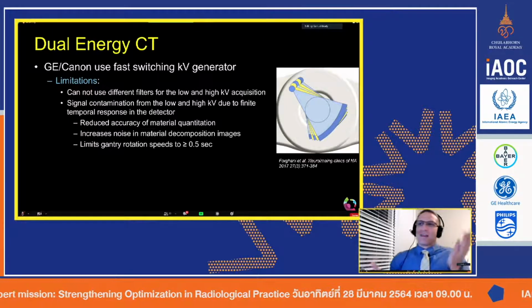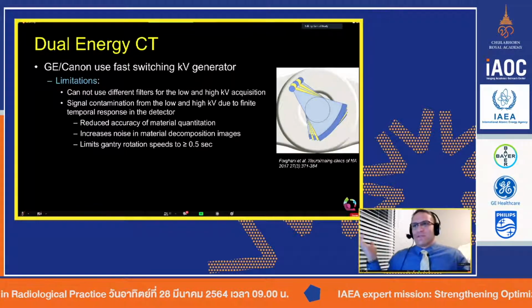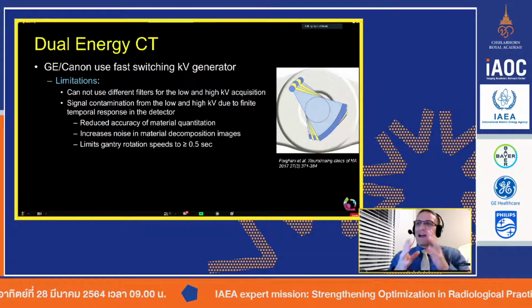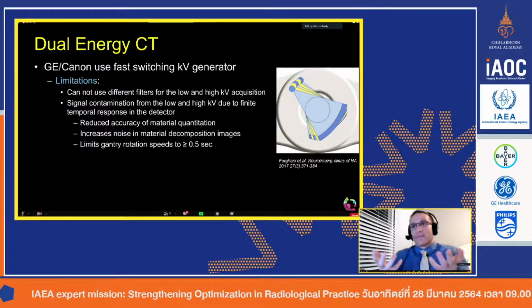And so I'm not saying one scanner, I'm not pro Siemens, I'm not pro GE, I'm not pro Hitachi. I've never used Hitachi. When they're neutral. Yeah, I'm very neutral. But you have to look at the pros and cons of every scanner and look at your population, your patient population. And then you'll make the right decision.